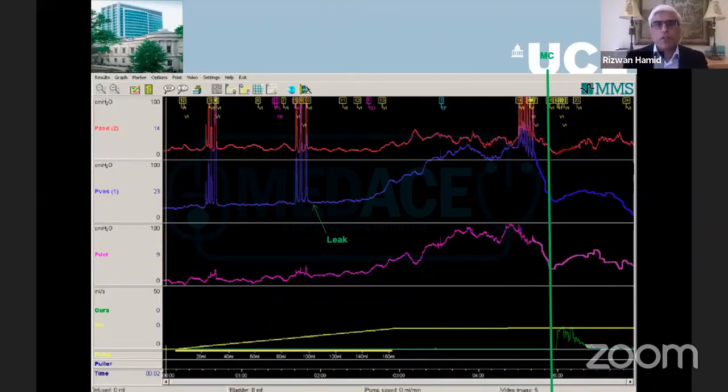I want to share with you the urodynamics based on the knowledge which has already been discussed. By convention, the red line is the abdominal line and the blue line is the vesical line. As Nazli said earlier, both generally should be positive because it's difficult to have a negative pressure inside. You zero the transducers to the atmosphere before you start, attached to the patient, and then you look at the subtracted detrusor line. This line, according to the ICS, can be between +5 and -5, the detrusor line, not the others, because these pressures cannot be negative.